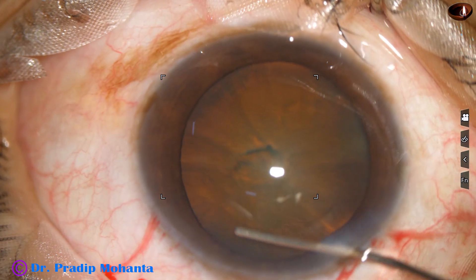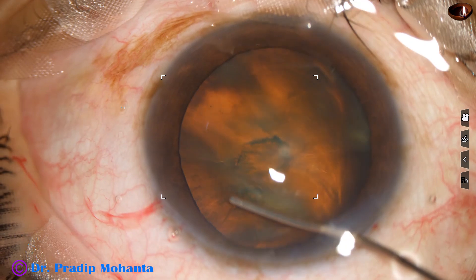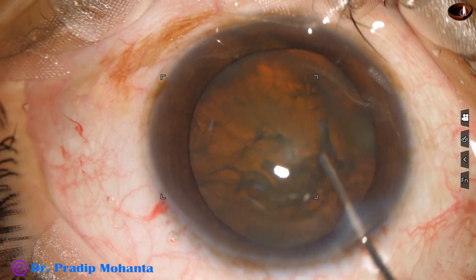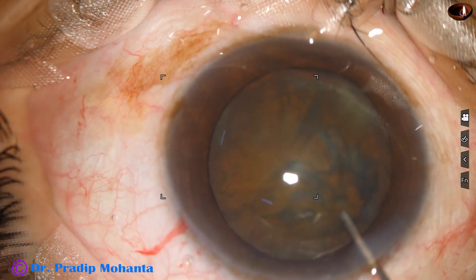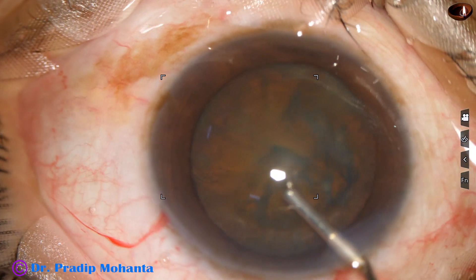And now, hydrodissection. The patient is diabetic, and in such cases the lens fibers are sticky — it means the fibers resist separation.